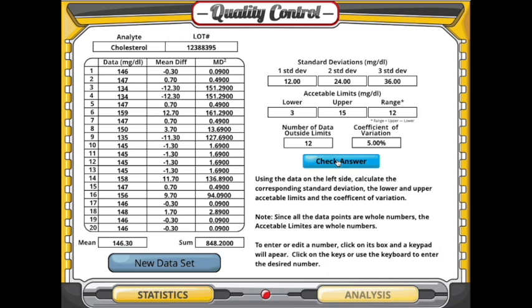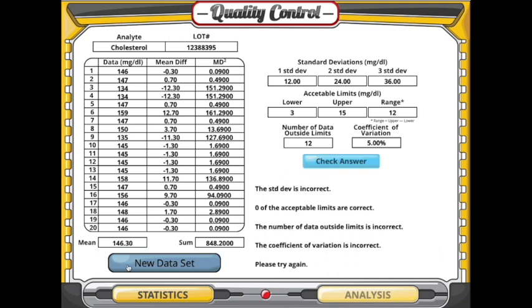Selecting the New Dataset button replaces this dataset with an entirely different analyte and dataset.